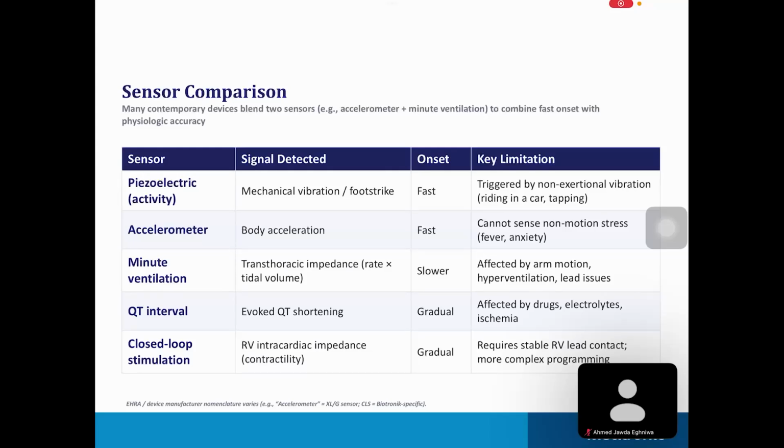But there is a feature, not in all pacemakers, called rate drop response. What does rate drop response mean? It is a feature. You may have a patient with DDDR mode, but this feature is not included in the pacemaker. We activate this feature in patients with vasovagal syncope, with a sudden drop of heart rate.